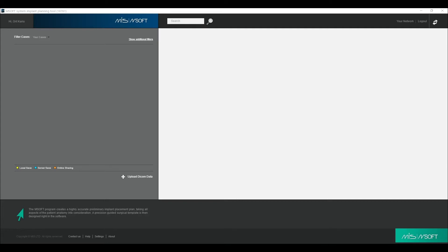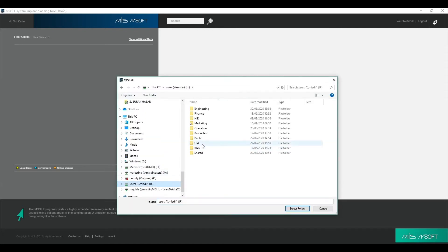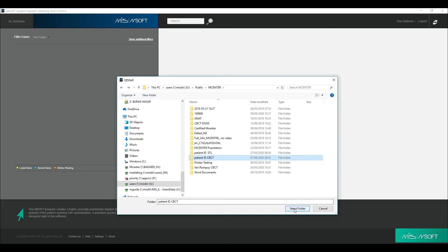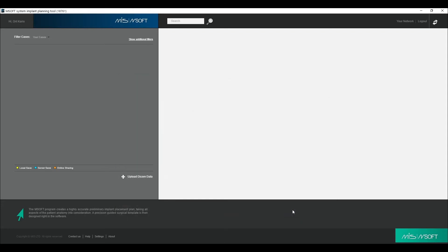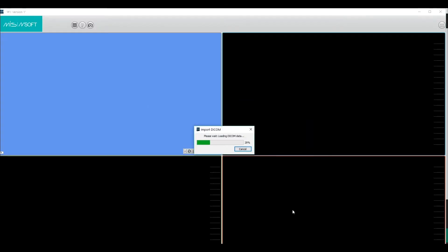This is the main screen in MSOFT. Click on the Upload DICOM Data Control and upload the patient's CBCT. The upload may take several minutes depending on the size and number of files.